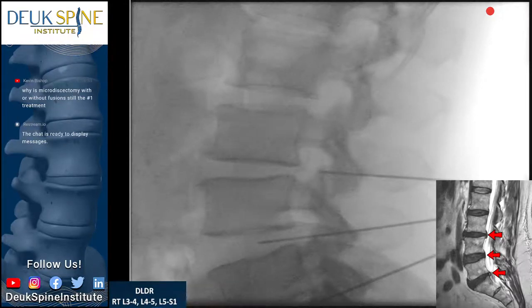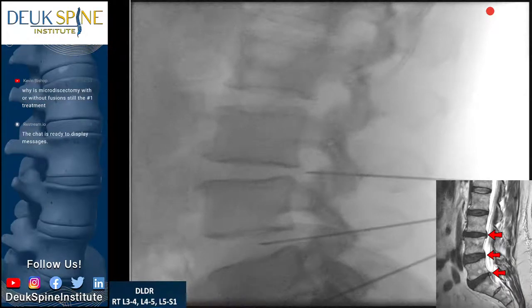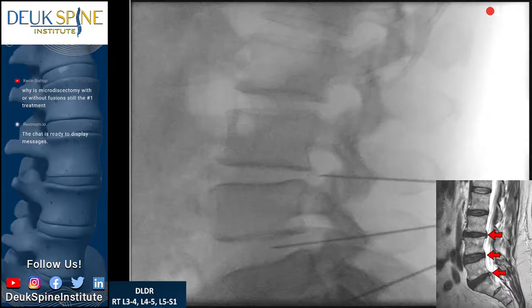Are you awake? Yeah. All right. Are you having pain in the back? Where is it? I can feel the herniation at the tip of that needle. Show the audience the tip of the needle with your arrow. You all see that white arrow? And right there, it's touching the herniation. See the herniation there? Normally, you can't see a herniation on x-ray, but you can actually see this one. Let's get an AP.